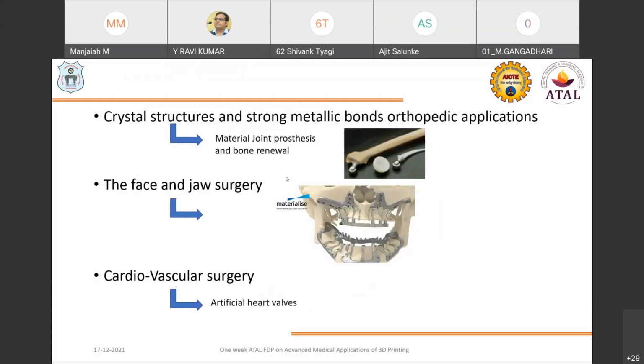That is the major advancement taking place in 3D printing with respect to medicine and the biomedical aspects. Even nowadays, tissues or organs are made with specific materials, and customized metallic implants can fit the tissues or the defects. A significant effort has been made by a lot of researchers to develop implants which are very closely related to the native bone structures or functional properties. That kind of development is taking place for metals and alloys in the 3D printing process.